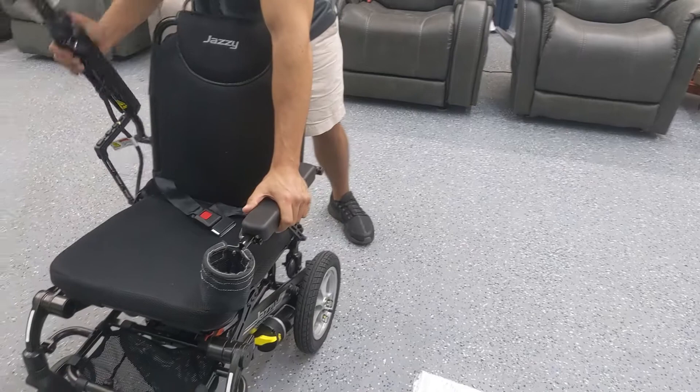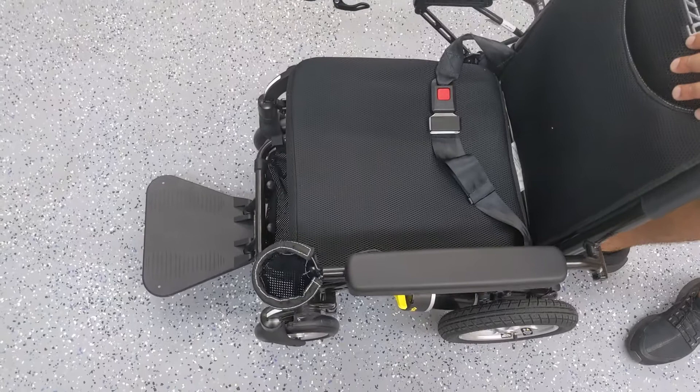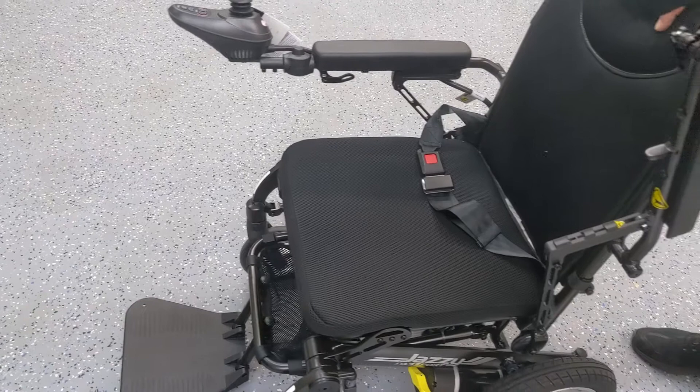The armrests are flip-up on both sides, so you do have the option to get them out of the way. It comes with a seat belt. The chair is padded and very comfortable — personally, this is a very comfortable chair for a folding power wheelchair. It also comes with a complimentary OEM armrest cup holder, not aftermarket, designed to work with the same railing system used for the joystick.